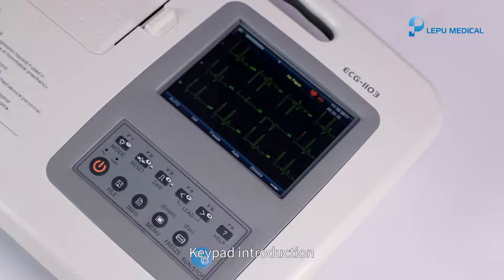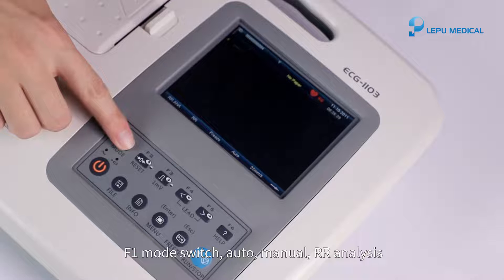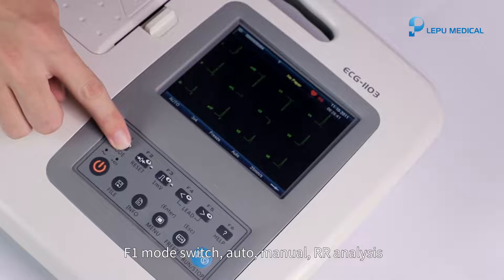Keypad introduction. F1: mode switch — Auto, Manual, RR analysis.